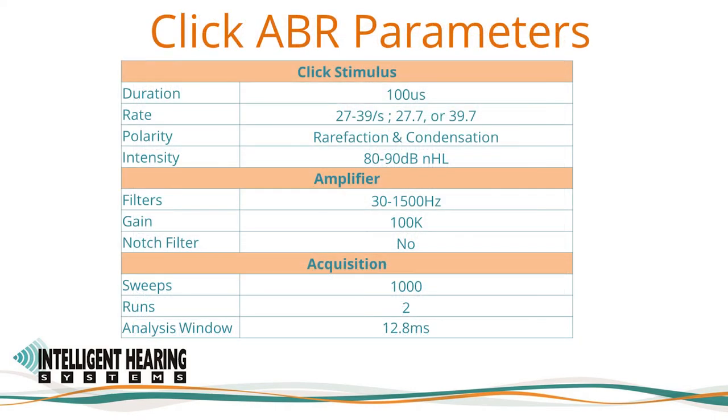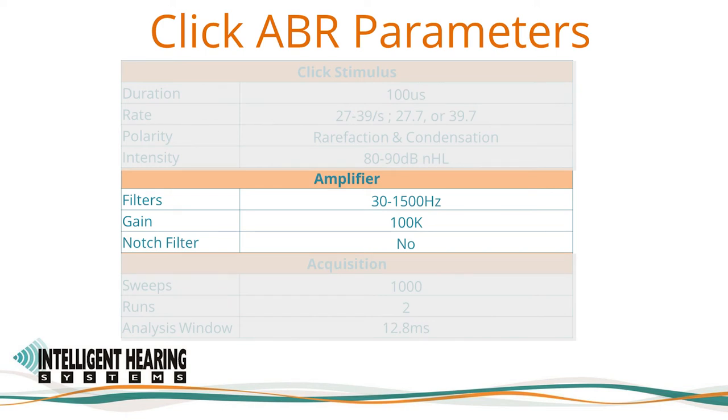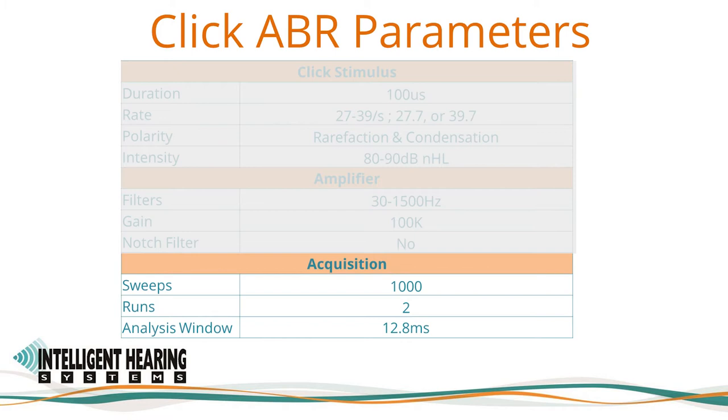Here are the parameters for the click ABR settings. ABRs are recorded using a high-level 80 dB nHL 100 microsecond click stimulus. The recording bandwidth is again from 30 to 1500 Hz for the infant click ABR settings. The amplifier is set to 100,000 amplification. The notch filter — 60 or 50 Hz depending on where you are located — is turned off but can be activated to reduce line noise when needed. 1000 sweeps will be recorded for each polarity. The responses will be plotted on top of each other to inspect for the cochlear microphonic. The recording analysis window is set to 12.8 ms.